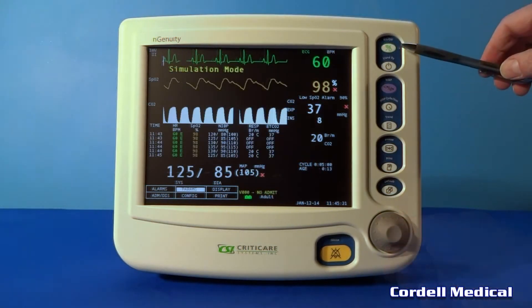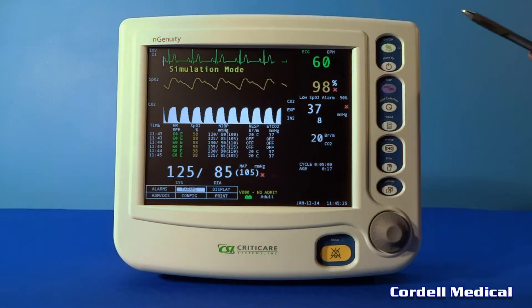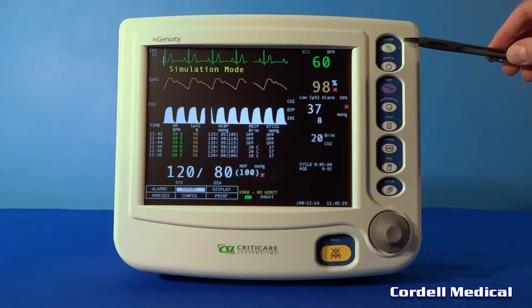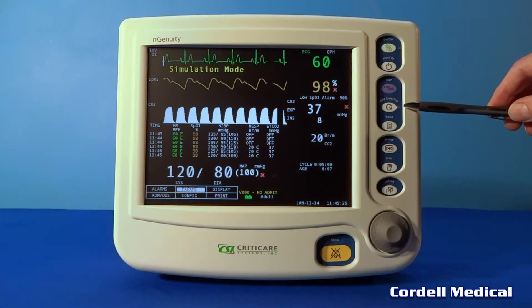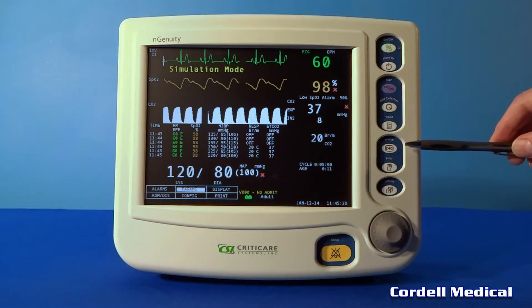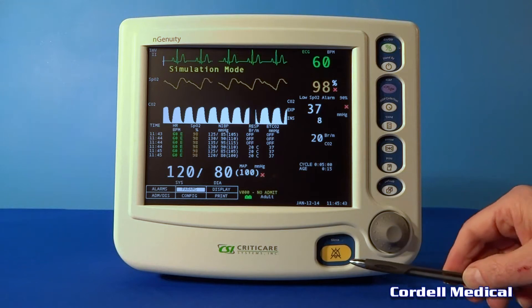There are nine dedicated function keys: the on-off button, standby, NIBP, NIBP cycle stat, trend, freeze, print, default, and silence.